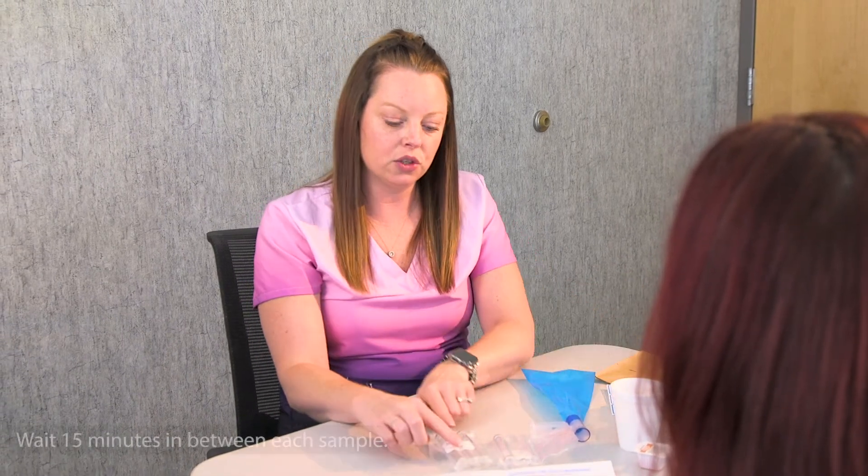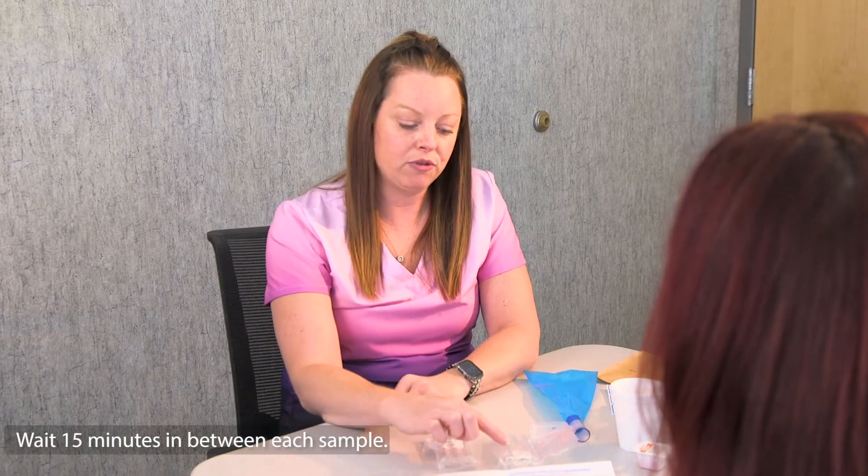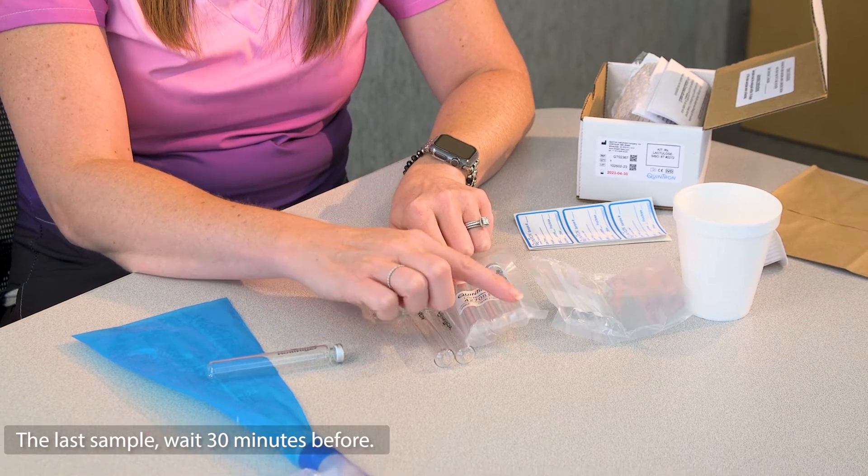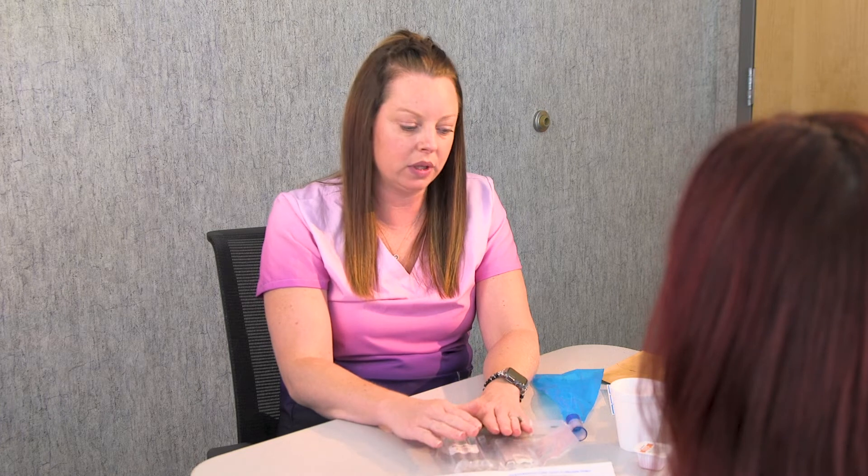For the other tubes, you're going to wait 15 minutes in between each sample. But for the last one, you'll wait a half an hour, and then you will be completely done with the test.